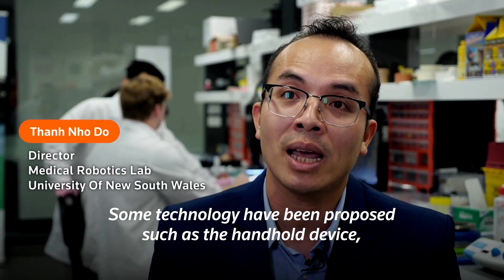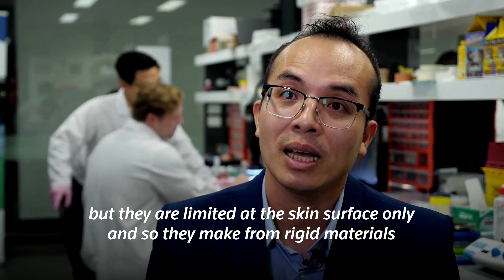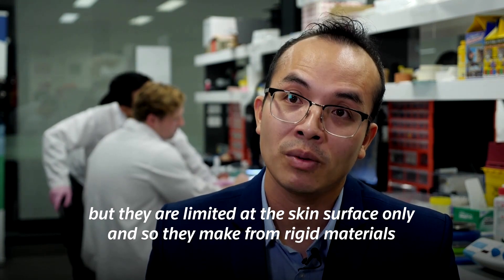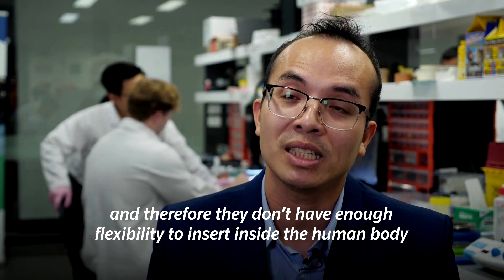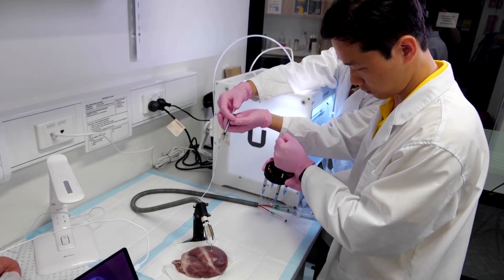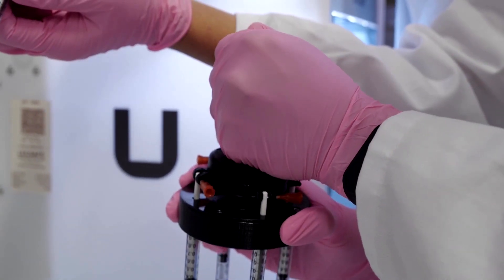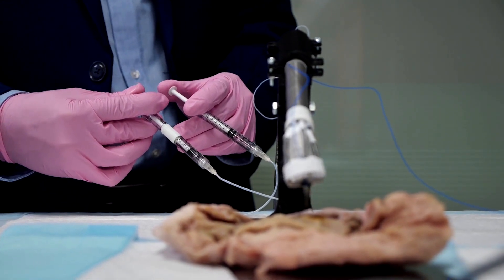Some technologies have been proposed such as the handheld device but they're only limited at the skin surface, and they are made from rigid materials and therefore don't have enough ability to insert inside the human body and perform the treatment. The F3DB robot features a three-axis printing head that can bend and twist using hydraulics on the tip of the soft robotic arm.